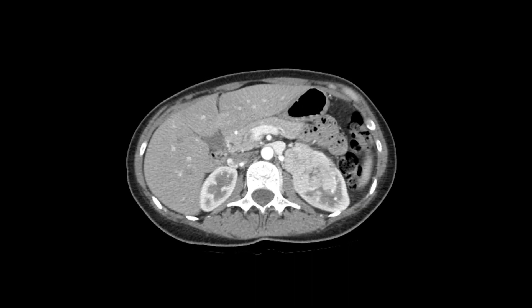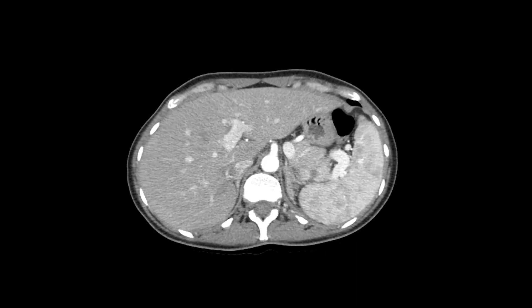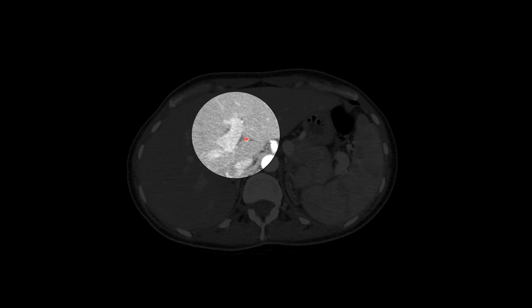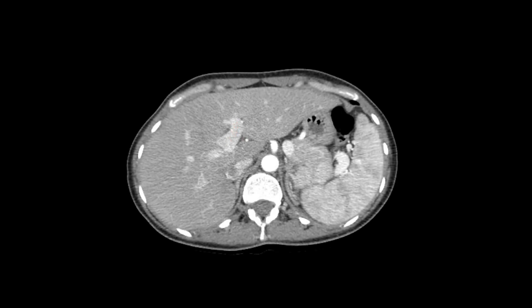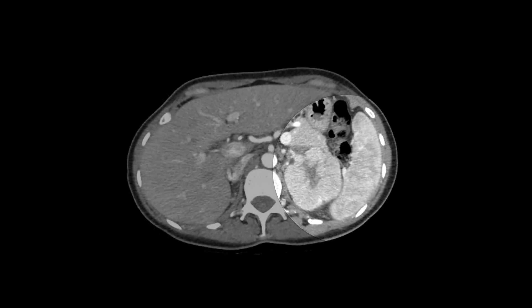What phase of contrast enhancement are we in? This is the corticomedullary phase — the renal cortex is enhancing but the medullary pyramids are not, and the aorta is quite bright, indicating the early post-contrast phase, usually about 35 seconds after contrast administration. This is also the same phase as the late hepatic arterial phase, where the hepatic artery and portal veins enhance but not yet the hepatic veins. This is also the phase of the arciform enhancement pattern of the spleen, with its tiger-striped appearance due to alternating bands of red and white pulp.